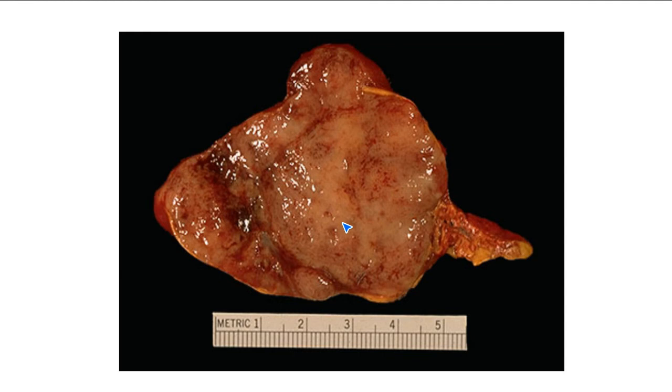Remember that hormones are secreted into the... What kind of stroma would these neuroendocrine tumors generally have? What would be prominent in the stroma? What structures would we see a lot of in the stroma?